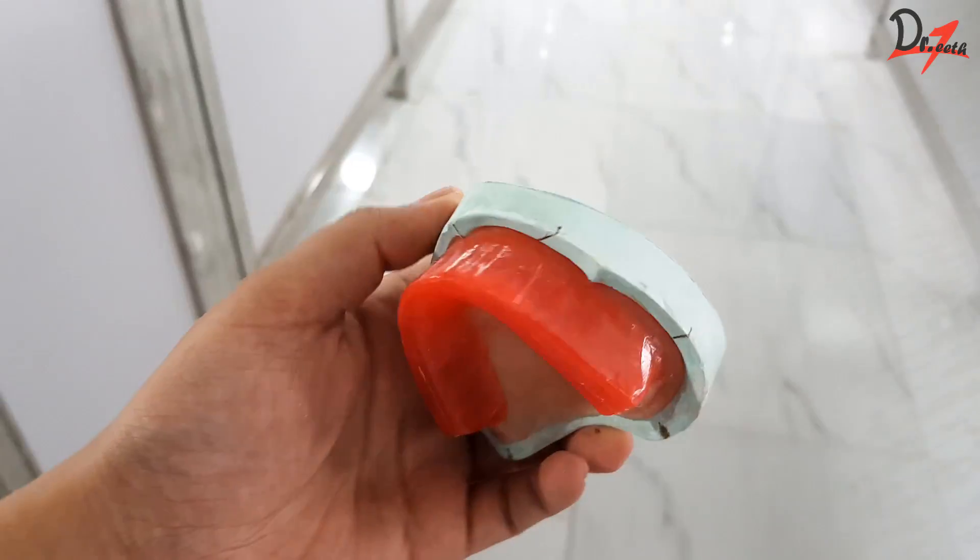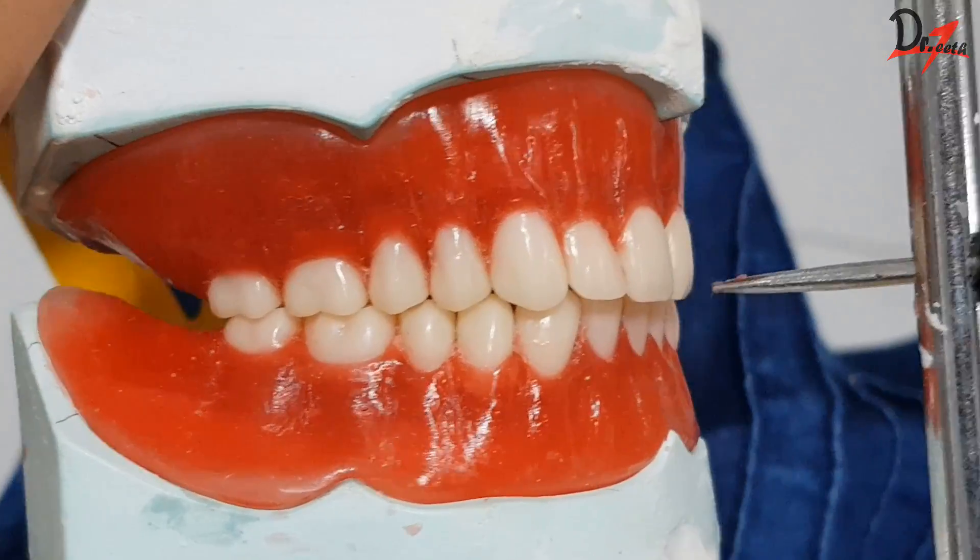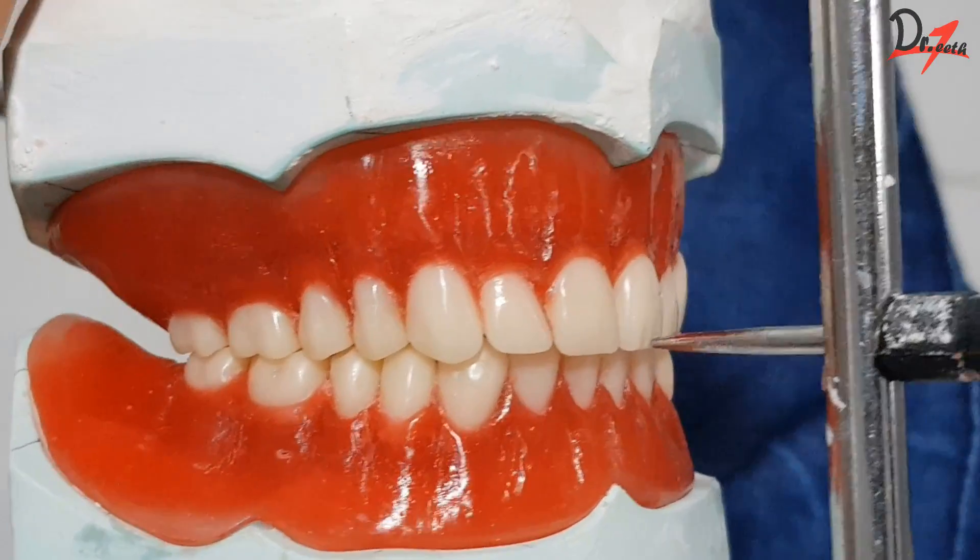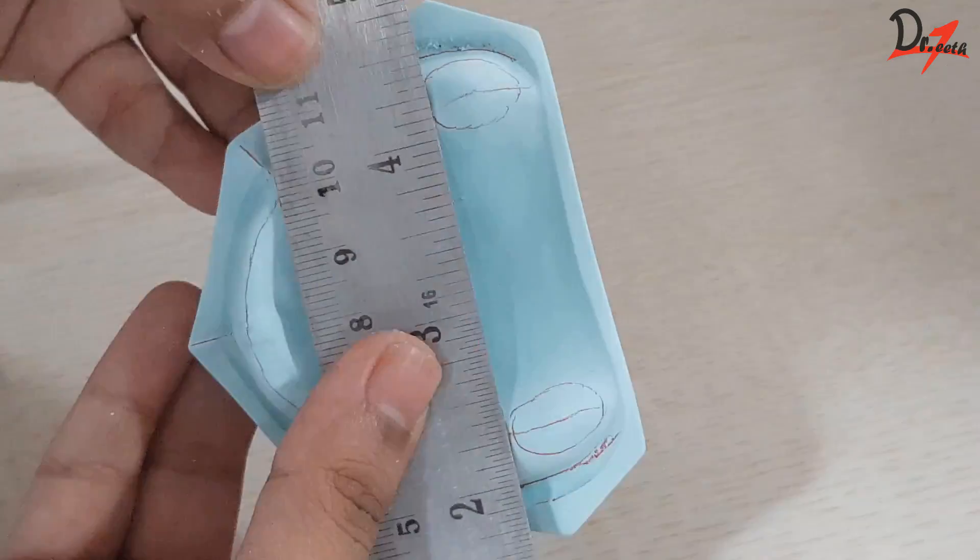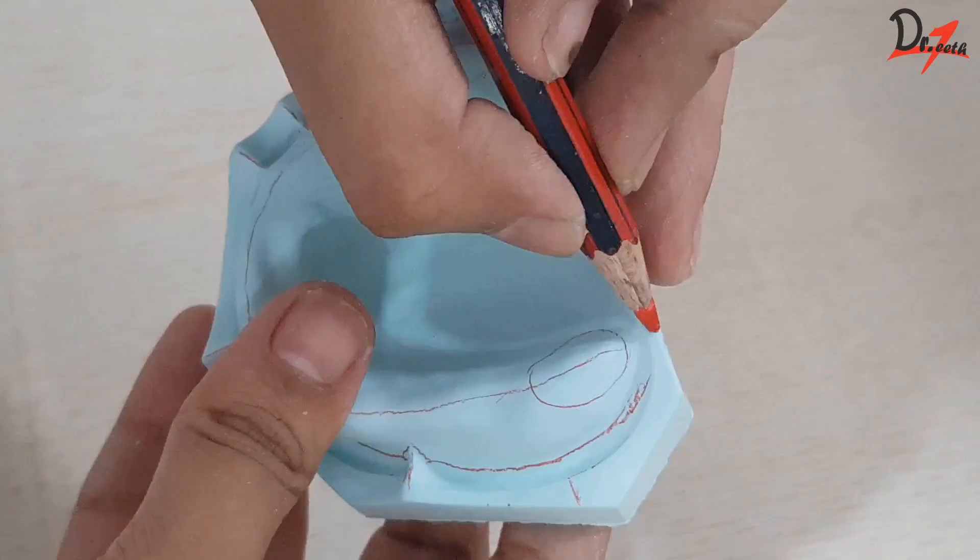Whether we are making a record base or we are making occlusal rim or while teeth setting, we need to have all these lines on the cast so that we don't make mistakes. These are the guidelines that we need to follow.